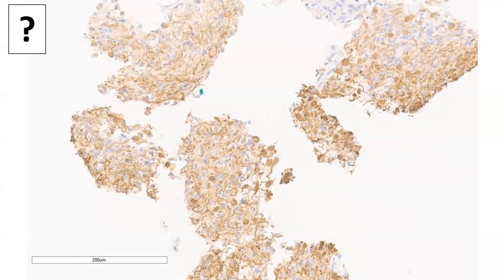I don't know. S100 would stain the nuclei also. S100 in gliomas stains nuclei and cytoplasm. Most tumors that express S100, it will be nucleus and cytoplasmic. The one exception to that frequently is chordoma. Chordoma often, with many of the S100 clones that are used, it will be cytoplasmic only, not nuclear.